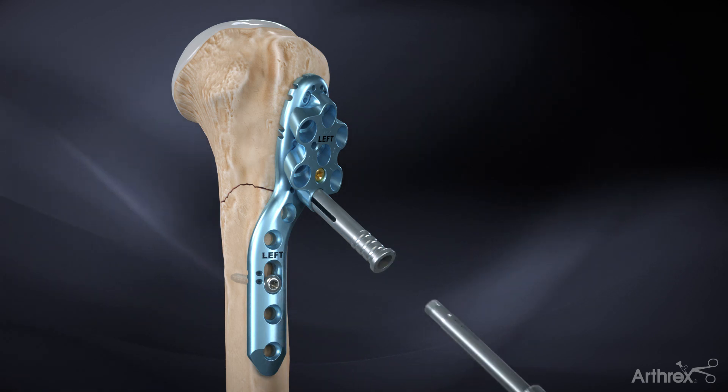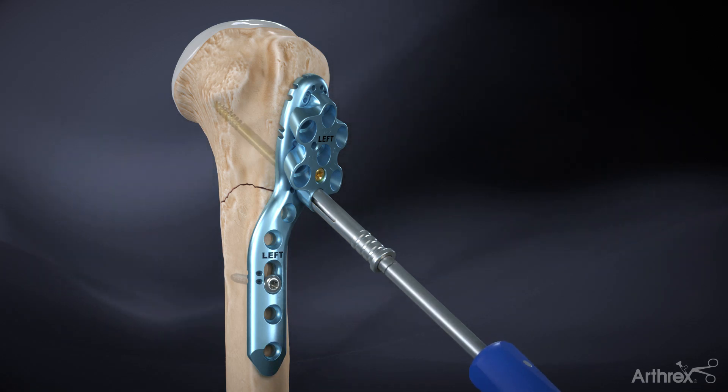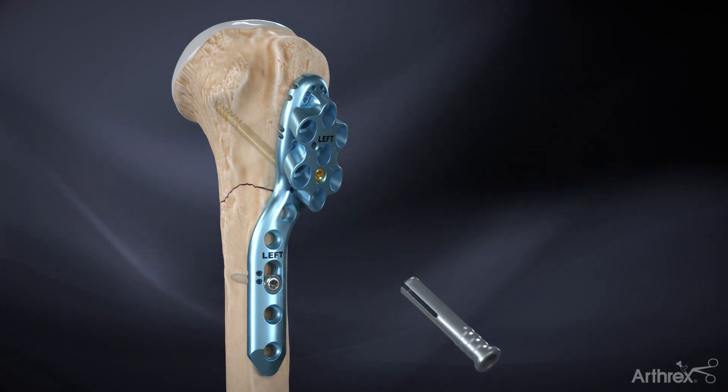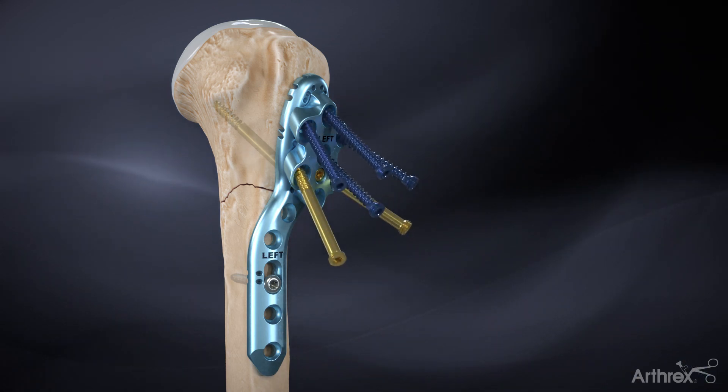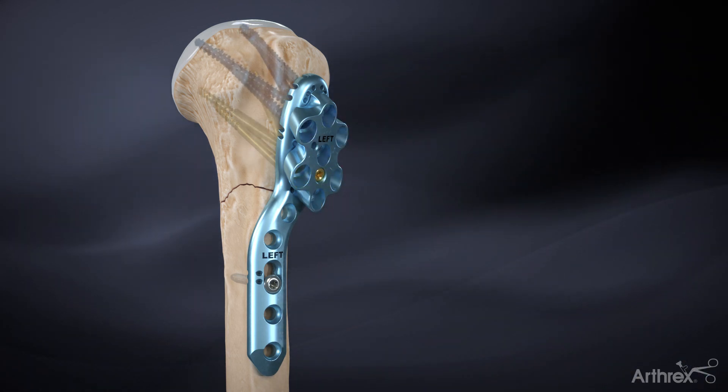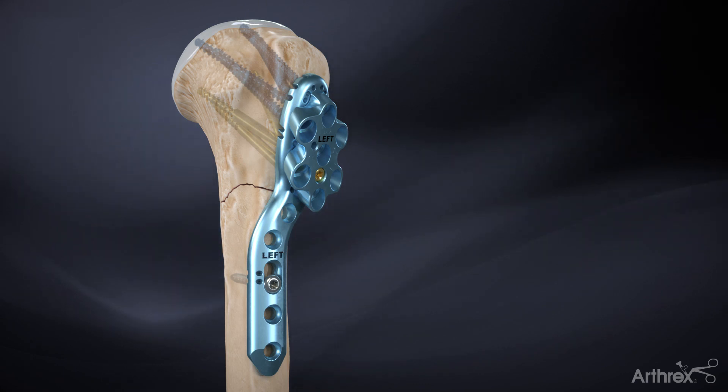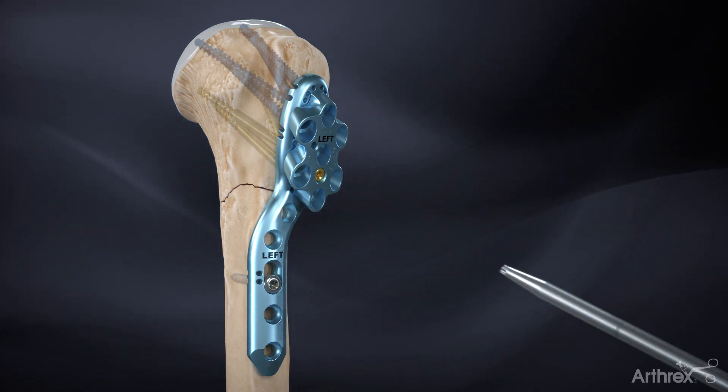Unthread and remove the drill guide from the sleeve and insert a 4.0 millimeter partially threaded locking screw through the sleeve. Repeat the following steps for the remaining proximal screws. The choice of fully or partially threaded 4.0 millimeter screws is based on surgeon preference. Once all the proximal screws are inserted, remove the alignment guide.